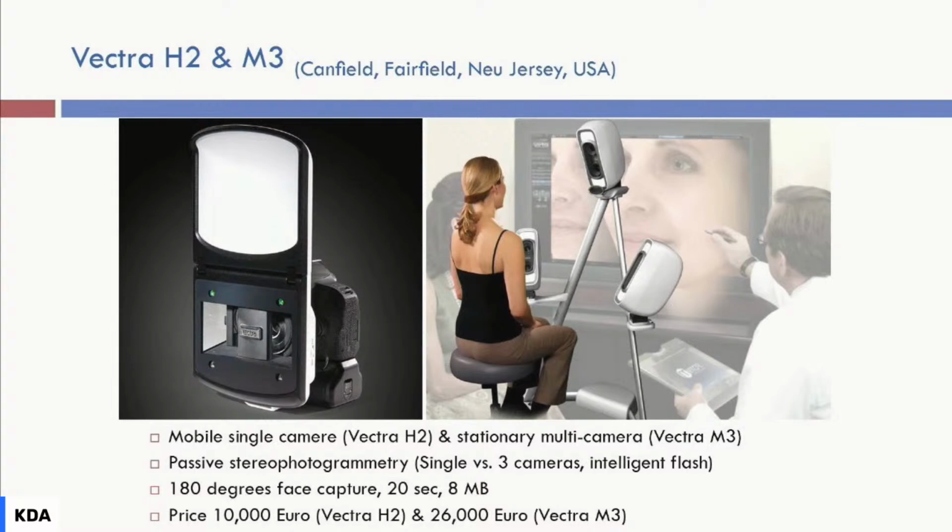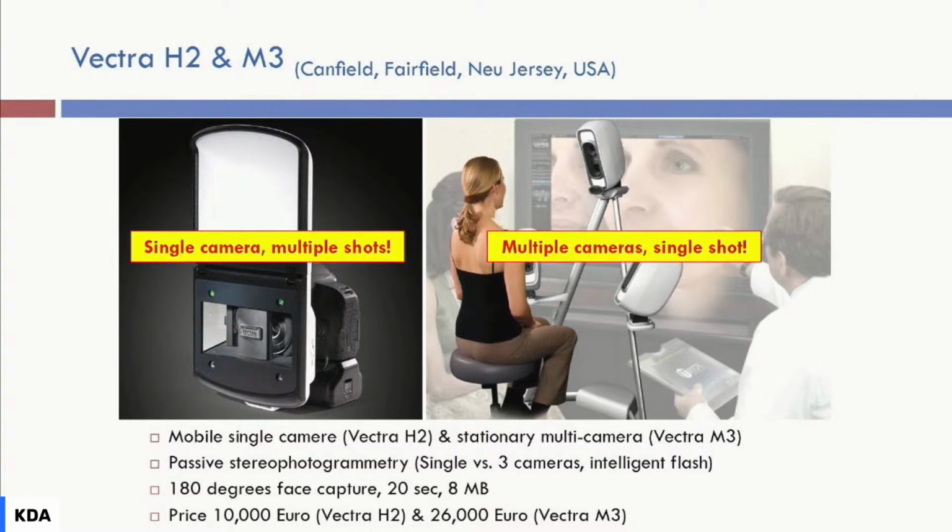You have the multiple cameras being set aside, and then the patient sits in the middle, in which multiple cameras take pictures simultaneously. So these are multiple cameras, single shot, or if you don't want to pay that price tag, then you can take the same camera, but you move around and take multiple shots with a single camera.